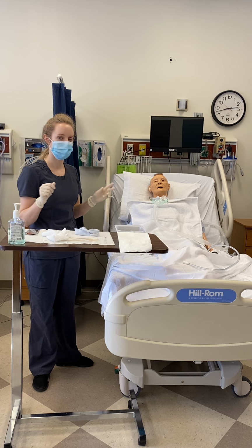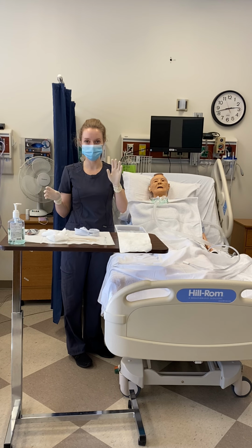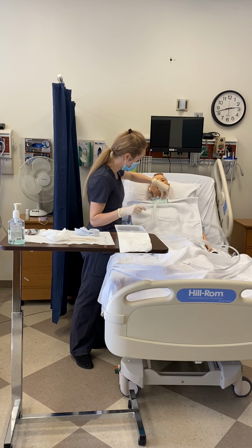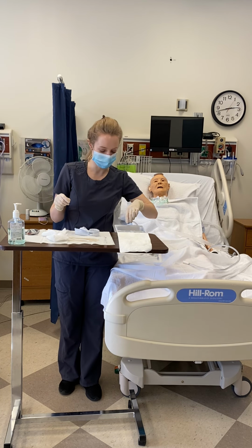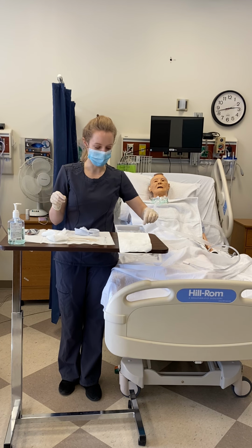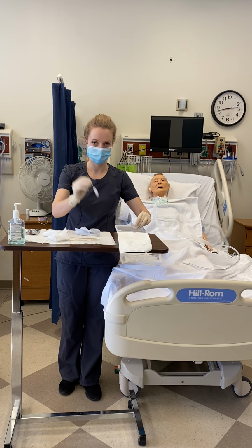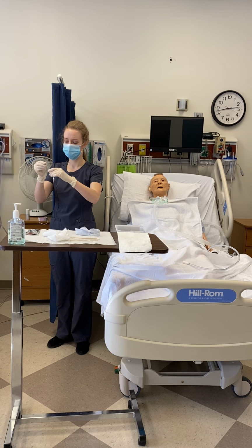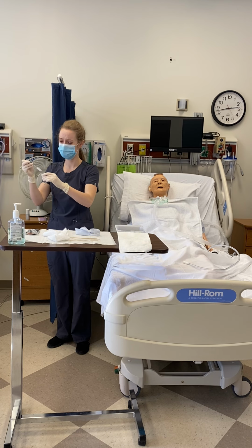My first step is to remove the inner cannula, which I will do by getting my non-dominant hand unsterile. So I pinch and twist the inner cannula. First, I drop it into the saline with hydrogen peroxide. Pick it up again with my non-dominant hand, with my clean sterile dominant hand I will scrub, making sure my fingers don't touch to not ruin sterility.